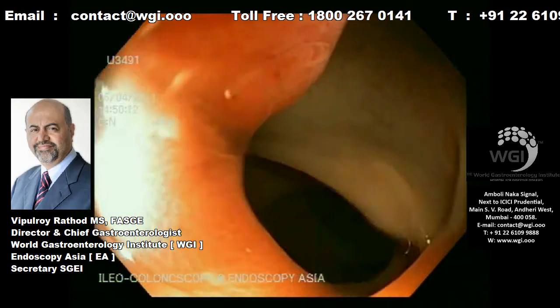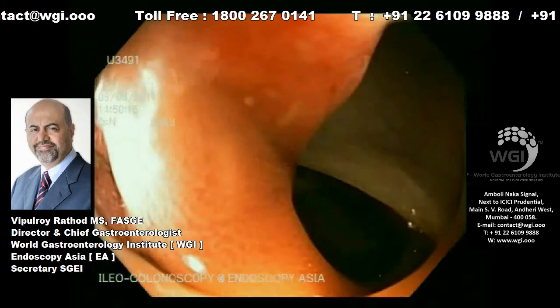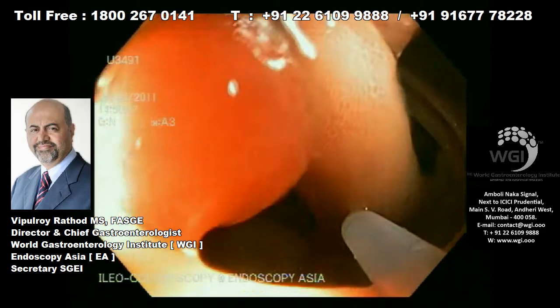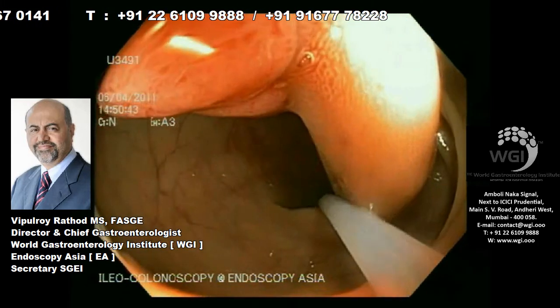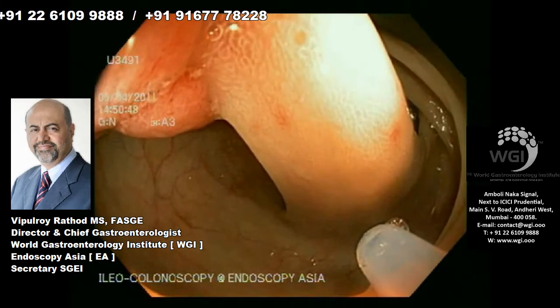I will bring the stalk to the 6 o'clock position. See how we have rotated the scope inside. By giving a torque on the scope, you can bring the stalk of the polyp in the direction of the working channel of the endoscope. Now we are going to inject diluted saline adrenalin with indigo carmin for staining.